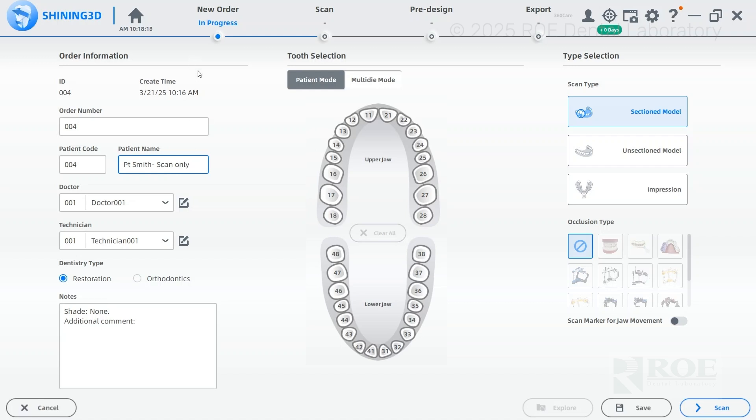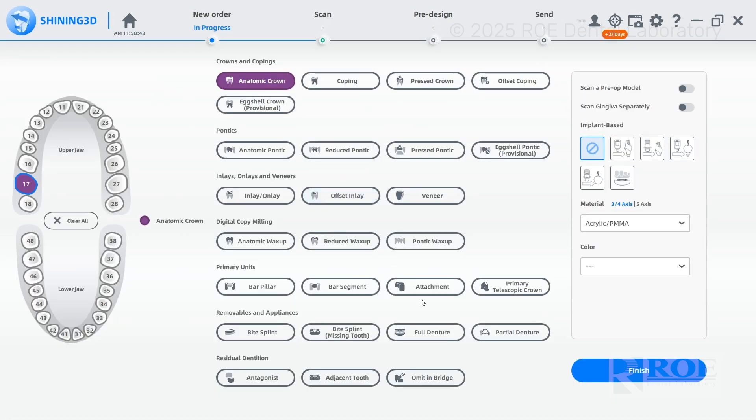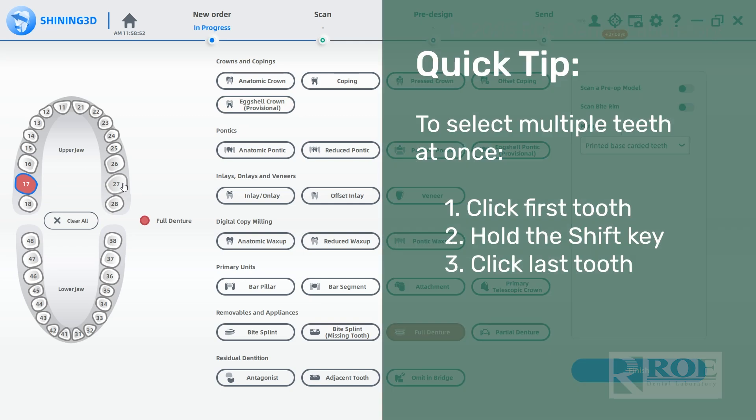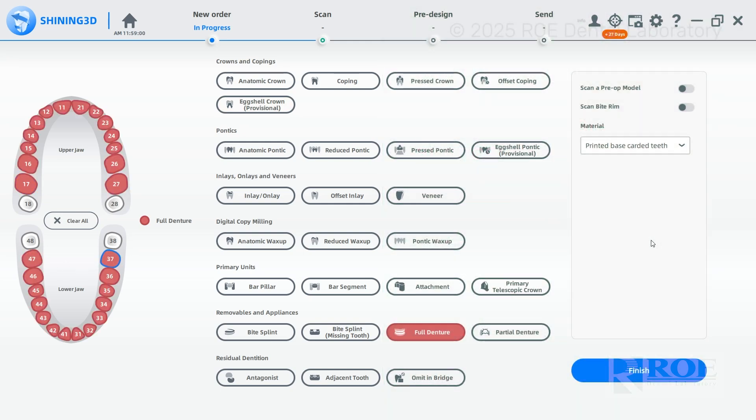We'll keep this as scan only — on record, not fabricating anything. Next, select any tooth and you'll see this menu come up. Go down to full denture and click on it. Make sure you uncheck the 'scan bite rim' box, otherwise you can misalign your scans. Then go to finish.